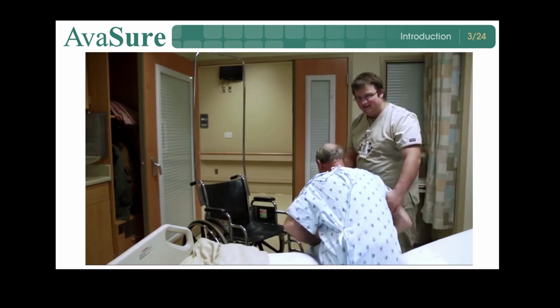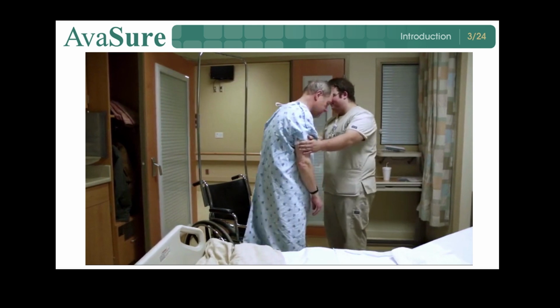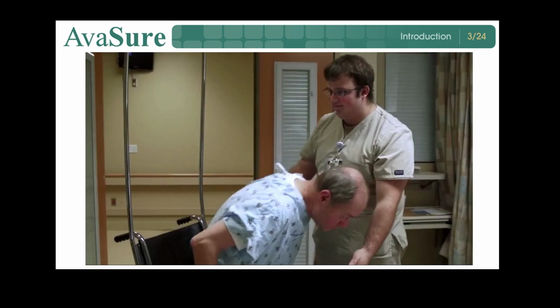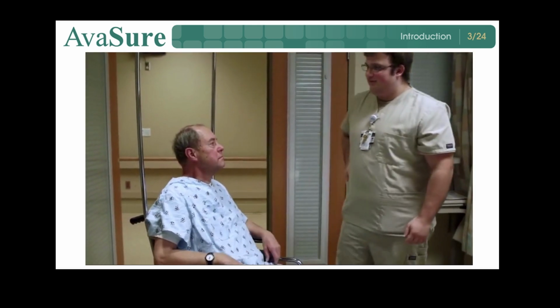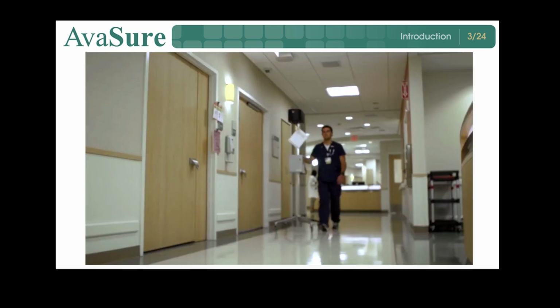When a patient is discharged or no longer requires video monitoring based on nursing assessment, an authorized staff member will notify the observer that monitoring should stop for that patient.